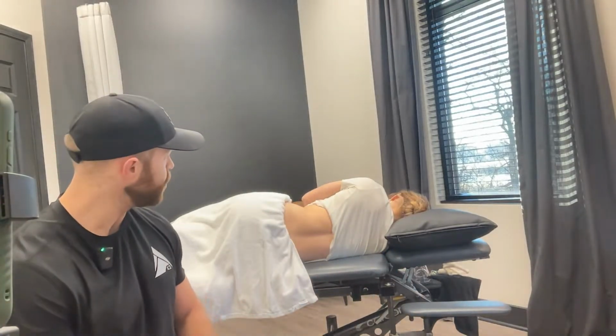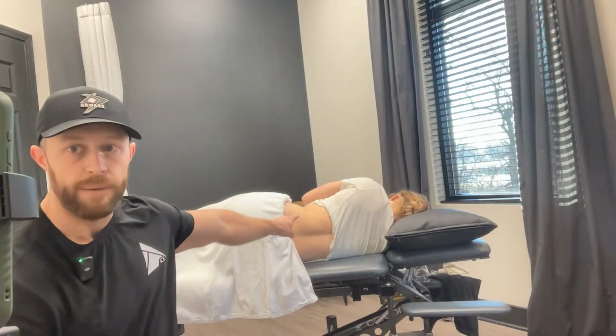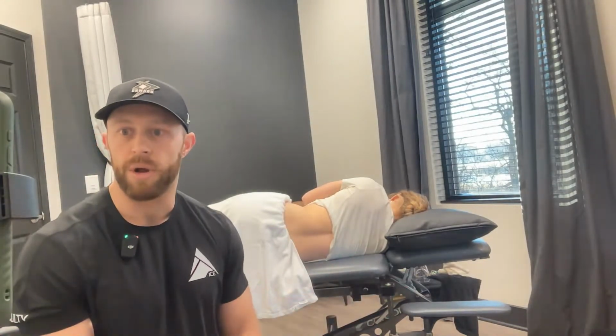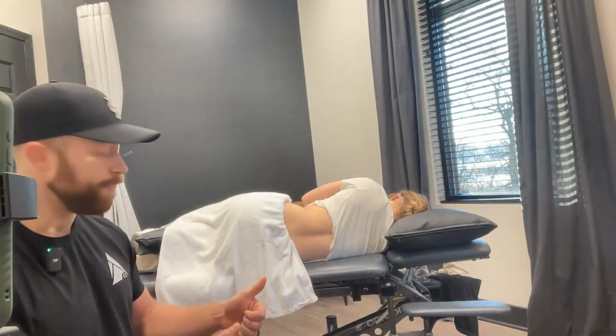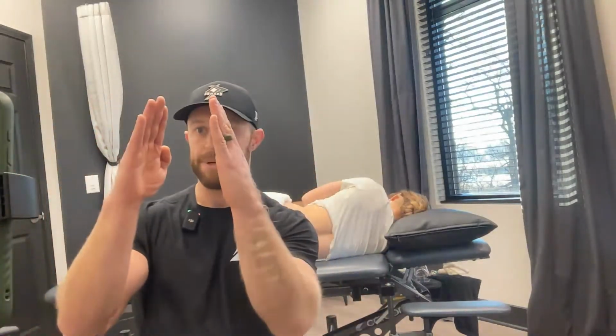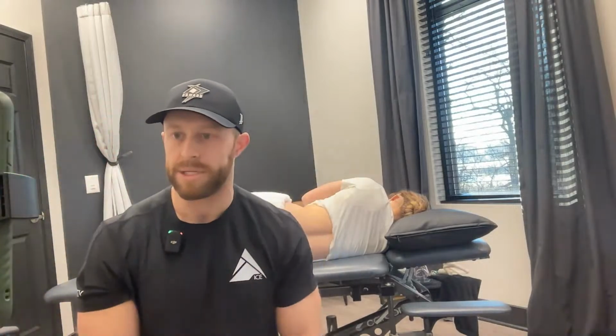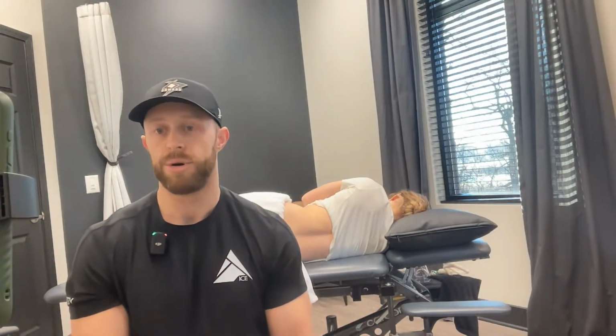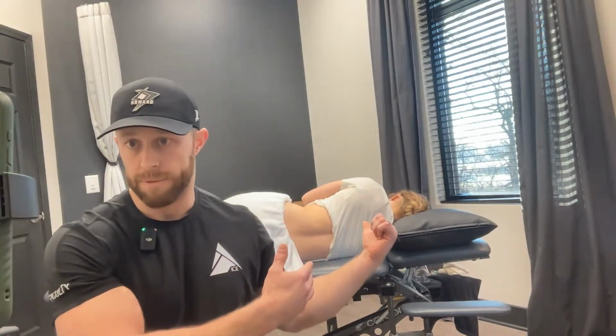So I have Caitlin here behind me, and you can imagine in this situation, her left erector would be the one that would be in spasm. So that's the one that I'm going to target with treatment, and that side's up. You also want to prop a pillow between the person's knees just so that hip doesn't adduct and create even more tension on that lower back region. Instead, let's keep those hips nice and neutral and get this person in a relatively comfortable position.